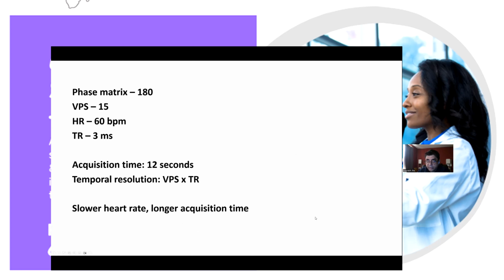The other interesting thing, which is kind of counterintuitive, is that the number of lines of K-space you require per heartbeat increases your temporal resolution. So if you require 10 lines of K-space per heartbeat, you have a faster temporal resolution than if you require 20, which creates an interesting counterintuitive trade-off, which is that the faster your acquisition, the worse your temporal resolution.